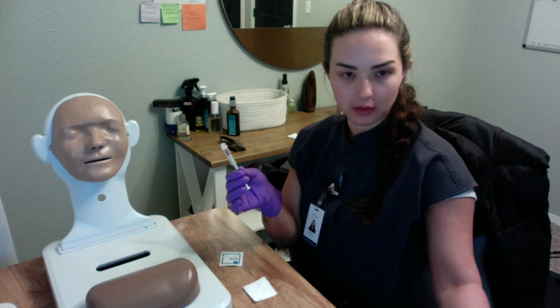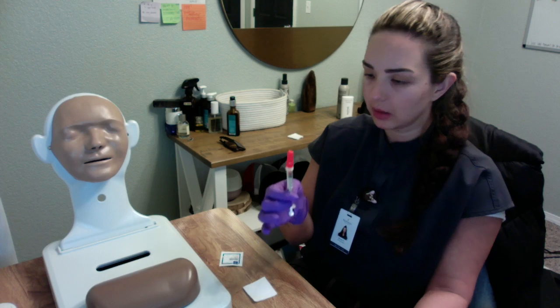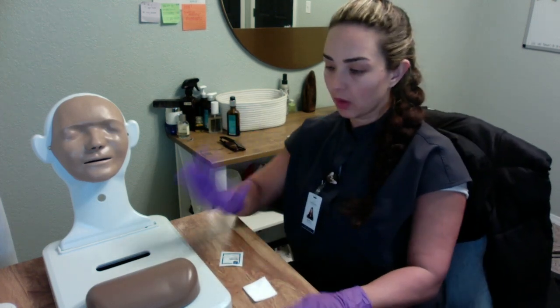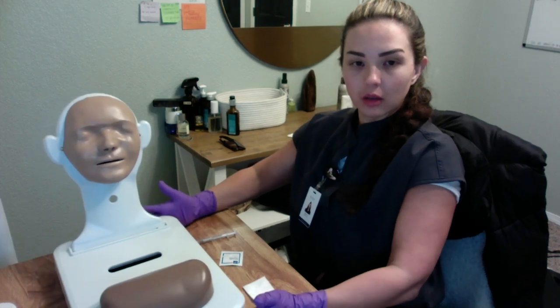Sometimes you have to inject the medication back in completely, but this looks pretty perfect. So I'm going to set this over here, and then we are going to scoop method with the needle top here, because again we're going to verify the medication dose, but we're also going to assess the location that we are going to inject for the patient.